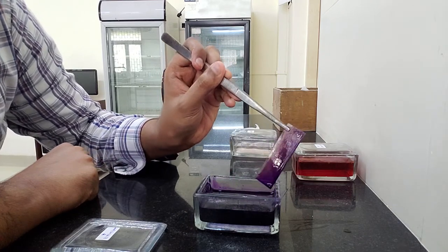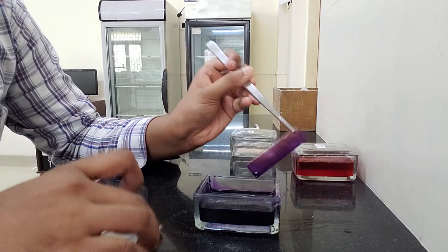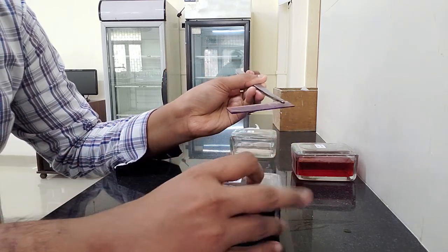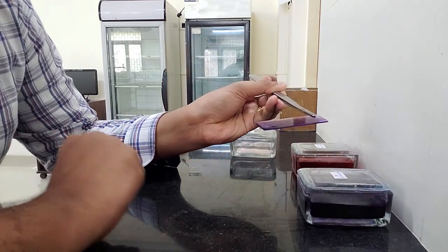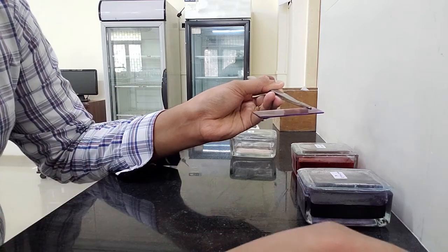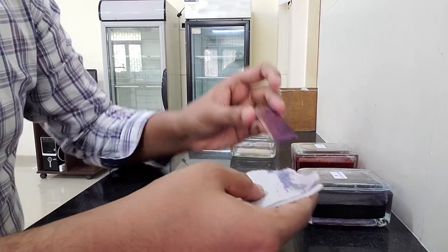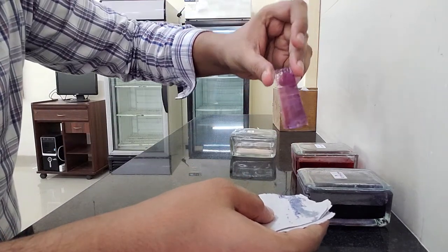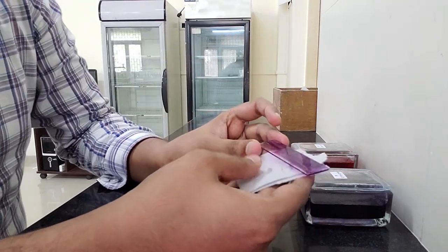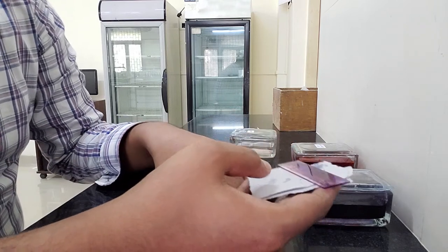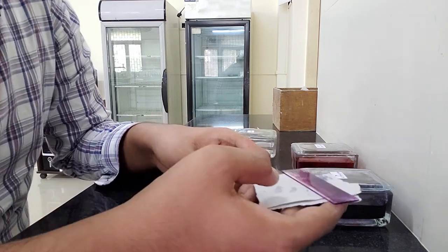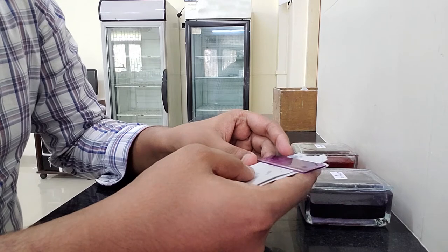Once that's done, once 10 seconds exposure is done, I'm going to gently remove my slide from it. I am going to close Field stain A and gently rinse it under water. After rinsing it with water, this is how my slide looks like. It's stained completely.